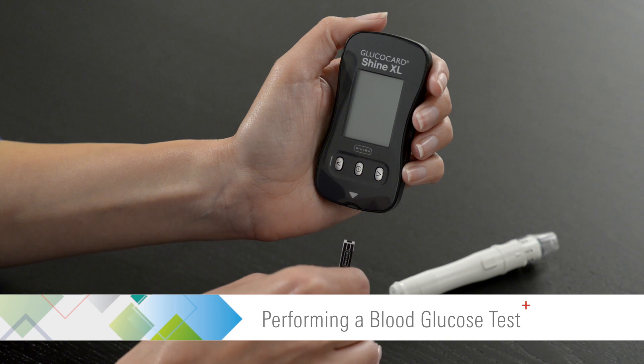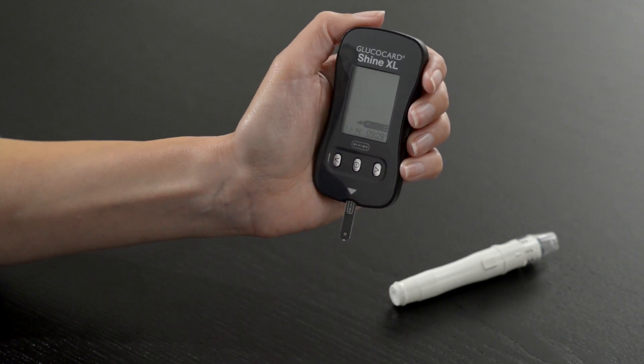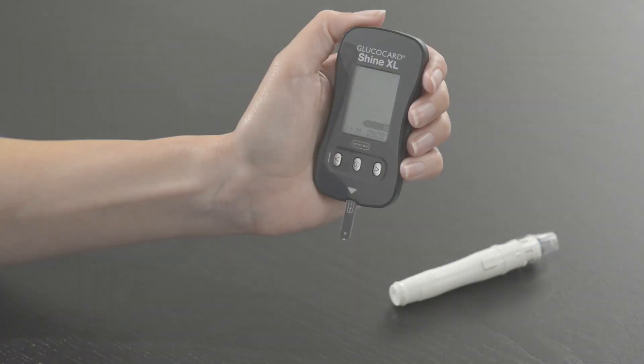Insert a test strip with the contact bars facing up into the meter. The apply blood sample symbol will appear. You are now ready to obtain a blood sample.